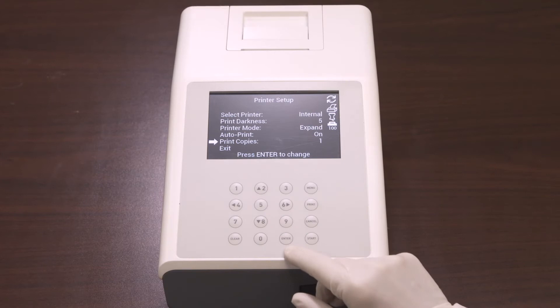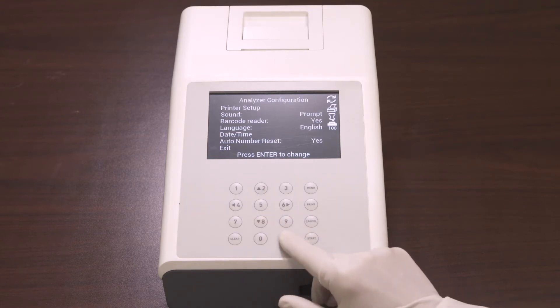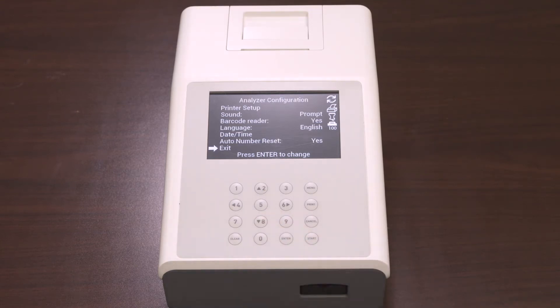Last but not least is Print copies. Print copies defines the number of test result copies printed at one time, and it can be set from 1 to 3. Once you've finished your selections for the printer setup, select Exit and press Enter to return to the main menu.